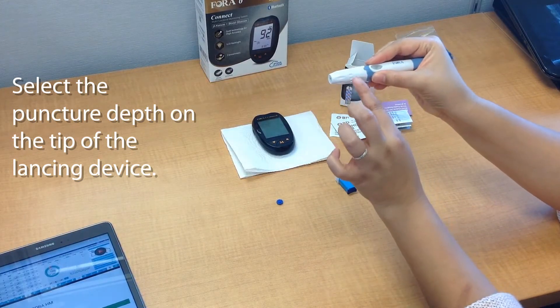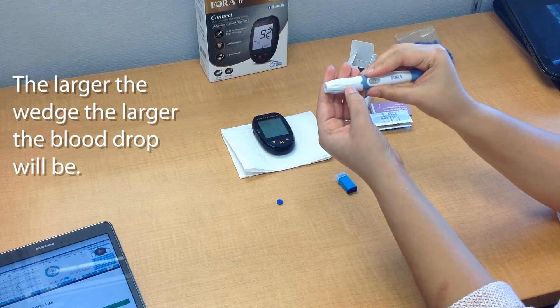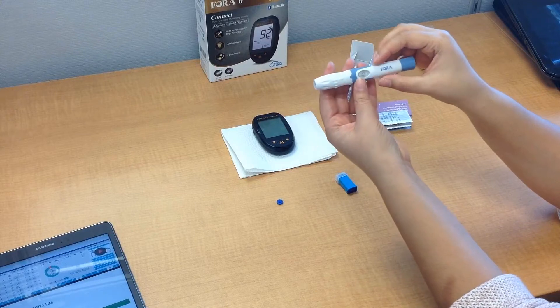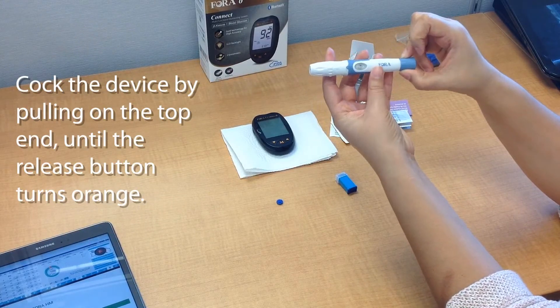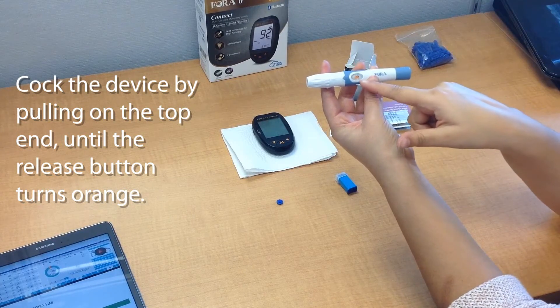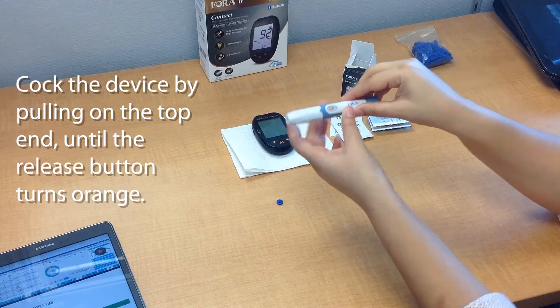Now you're going to select the depth of the puncture. You'll see these little wedges on the tip — the larger the wedge, the larger the blood drop will be when you puncture the testing site. Then go ahead and cock the device by pulling on the end, and you'll notice that the ejecting button turns orange, which means it's ready to go for the test.